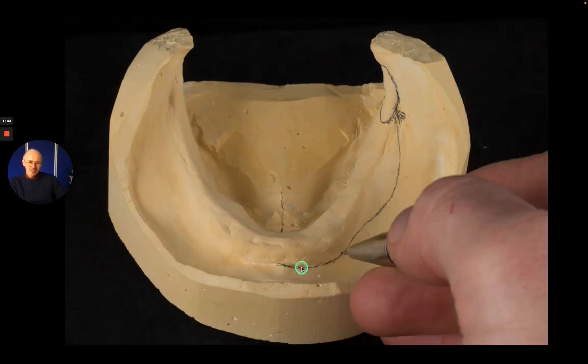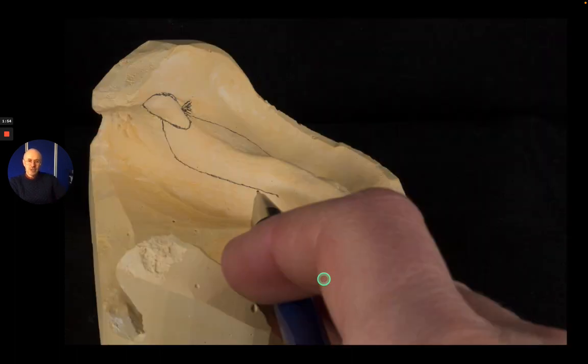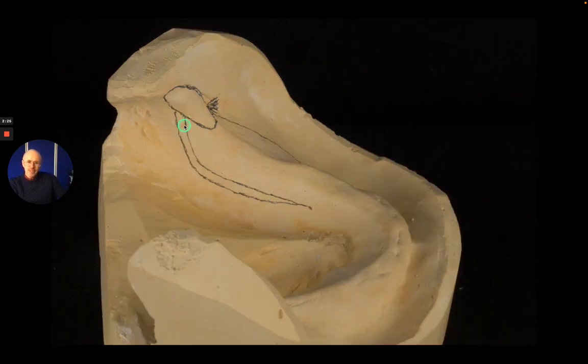Bring this further forward, and then this front section here I want again to be two millimeters short of the functional depth of that sulcus, so this is going to be recorded in the impression material. If we flip over to the other side and look from the top to the bottom of the retromolar pad, I then draw a vertical line from the middle of the retromolar pad, bring that down, and then sweep that onto the mylohyoid line, bringing it forward to about the canine region, which is where the sublingual gland comes up. I then draw a second line which is two millimeters behind this, draw that down vertically, follow my first line, and join it up at the divergence point.